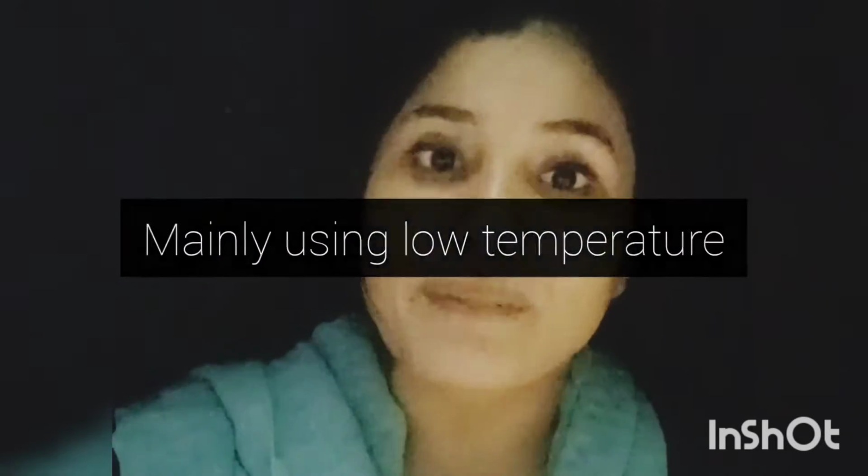It is divided into two categories: high temperature and low temperature. A natural example of high temperature plasma is lightning. In plasma sterilization we use the low temperature method, mainly because gas plasma sterilization is used for instruments which cannot withstand high temperature.